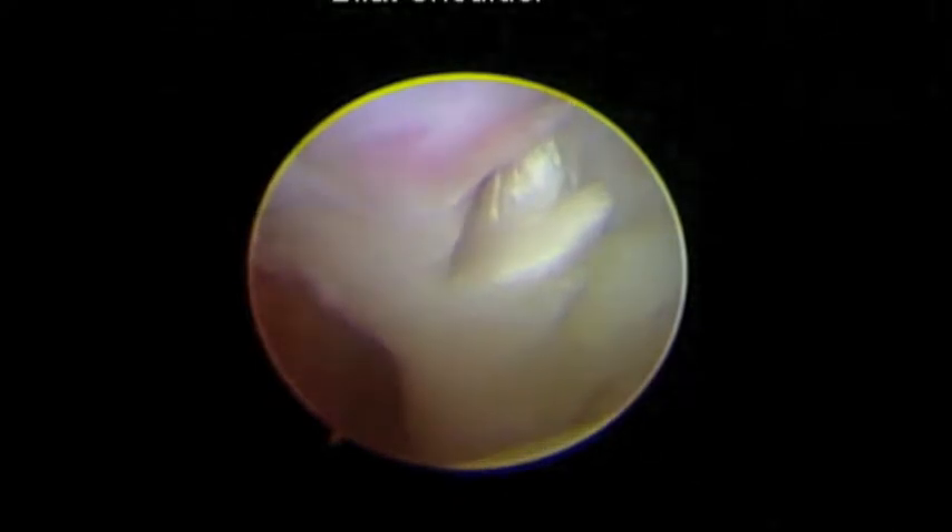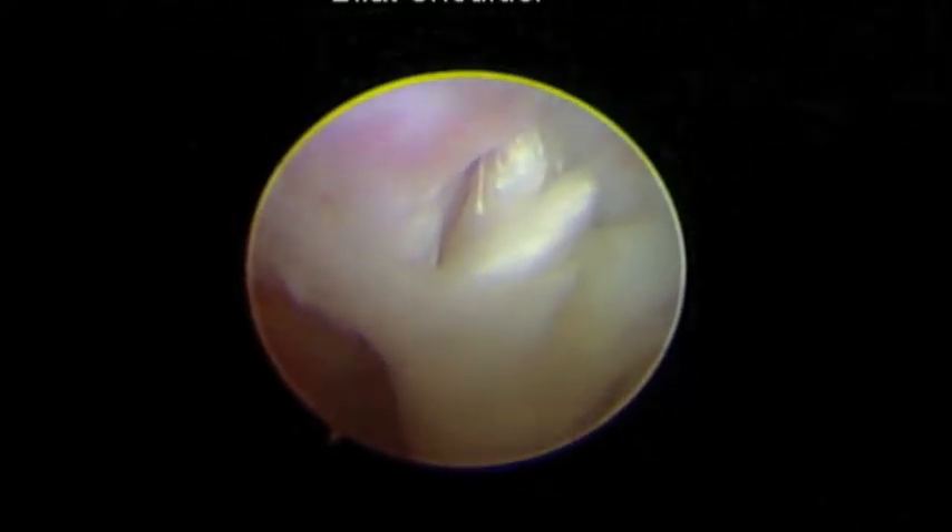What you're looking at here is the biceps tendon. As you can see, the tendon at the very top to the right looks like somebody took an axe and just chopped it right in half. There's probably only about 10 to 15% of this tendon still attached to the bone, if that — so it's completely ripped off.